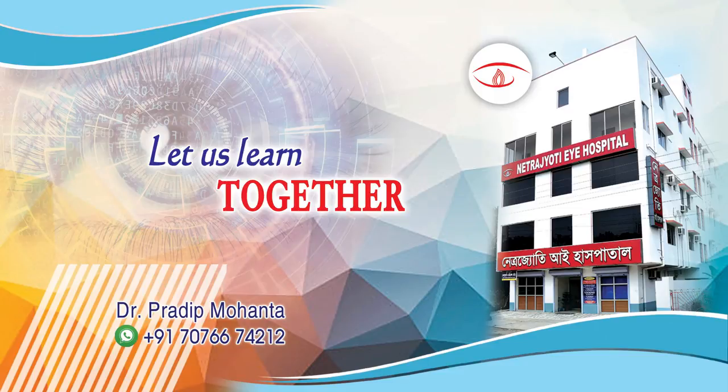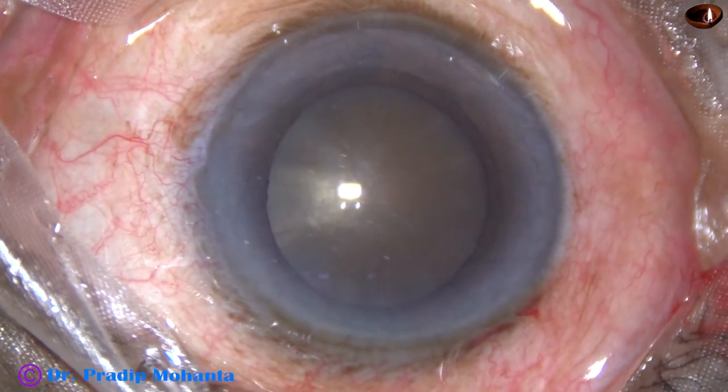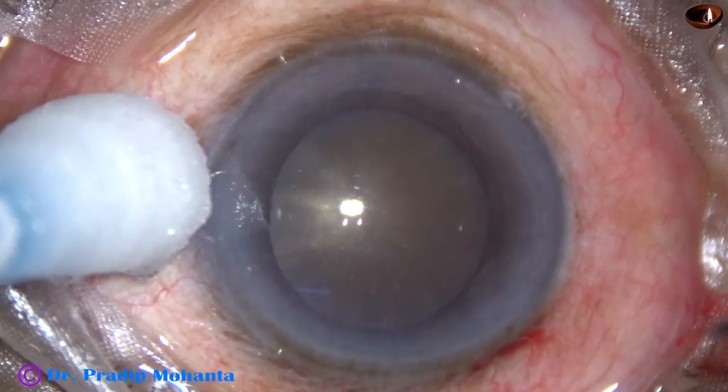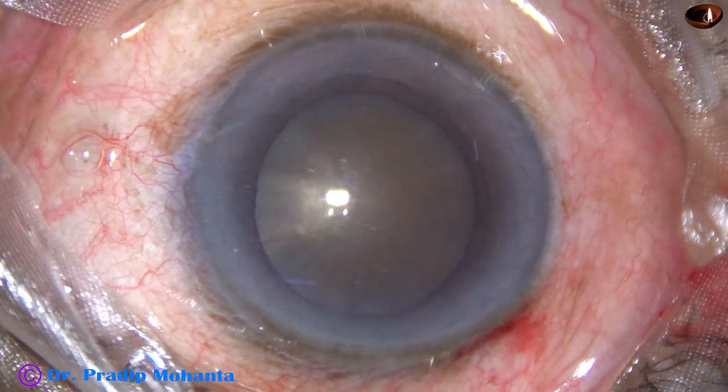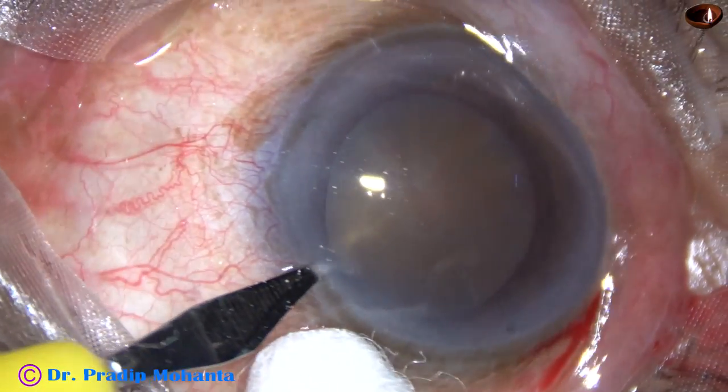Friends, welcome to my workplace at Ranaghat, West Bengal, India. This is a very hard cataract. Look at the brownish-black appearance of this cataract. Let us observe phacoemulsification of this granite hard cataract.